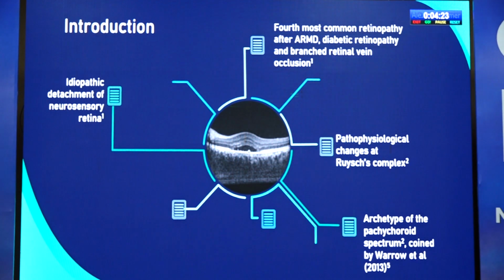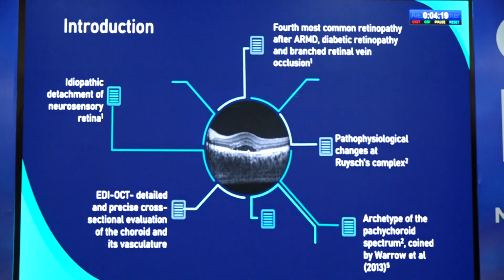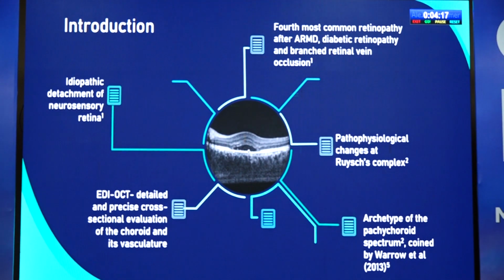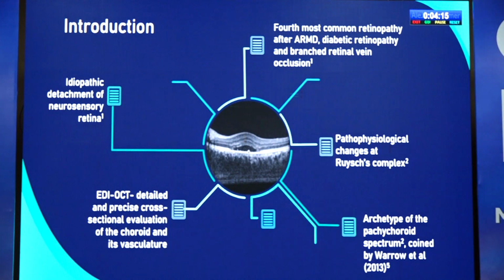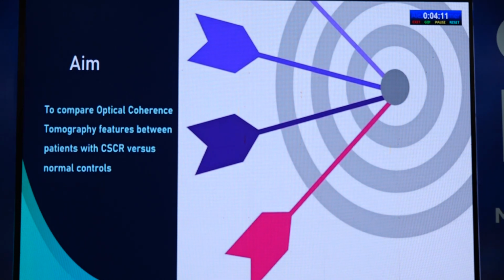The term was coined by Warrow et al. in 2013. And EDI-OCT enables us for a detailed cross-evaluation of the choroid and its vasculature. The aim of my study was to compare optical coherence tomography features between patients with CSR versus normal controls.